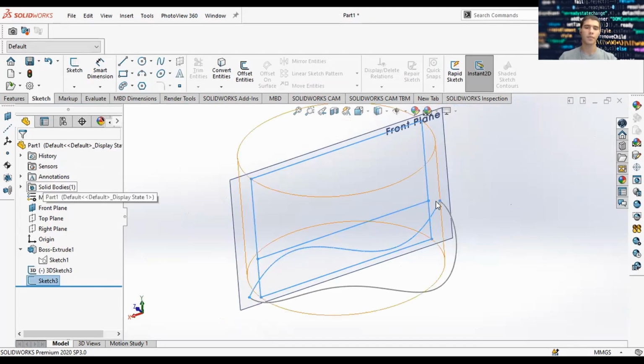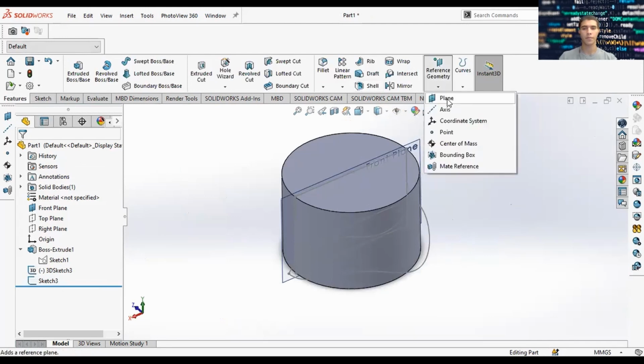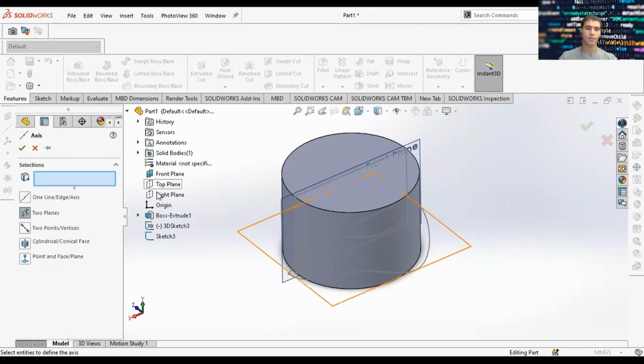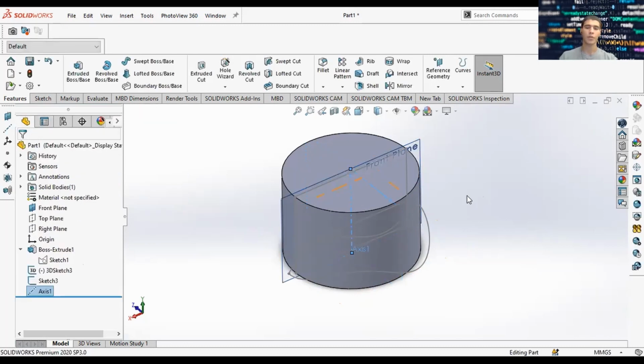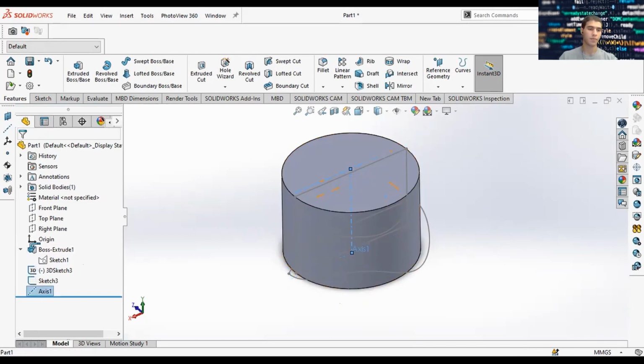So there we have our cross section, and now let's include some reference geometry. One axis. So include an axis with our front and right planes. And this will be helpful later when we're using different features, because with this reference geometry, you can orient stuff around that axis.